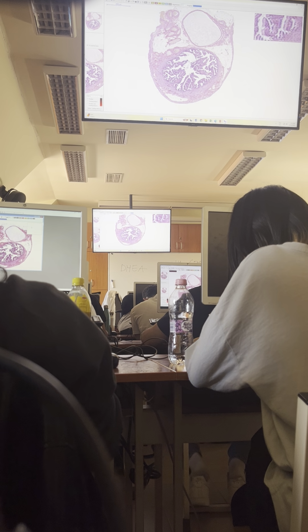Okay, so the thing that these mucus-producing cells look dark, essentially basophilic, is probably that here the mucin was preserved, and mucin is a basophilic substance if it is preserved. Okay. And obviously the movement of the cilia are important in the transport of the oocyte.